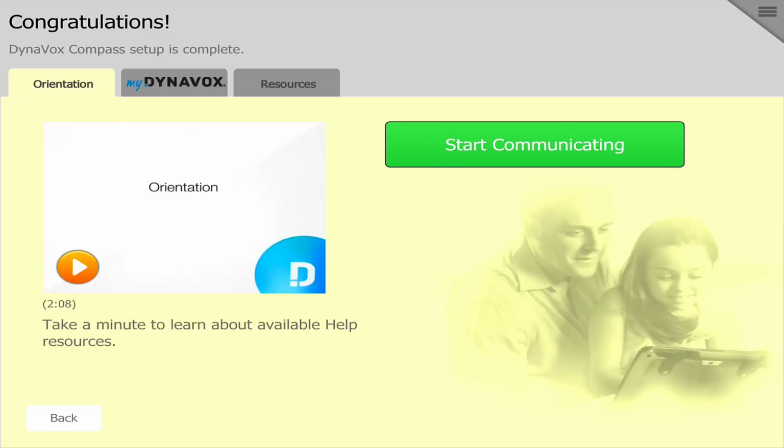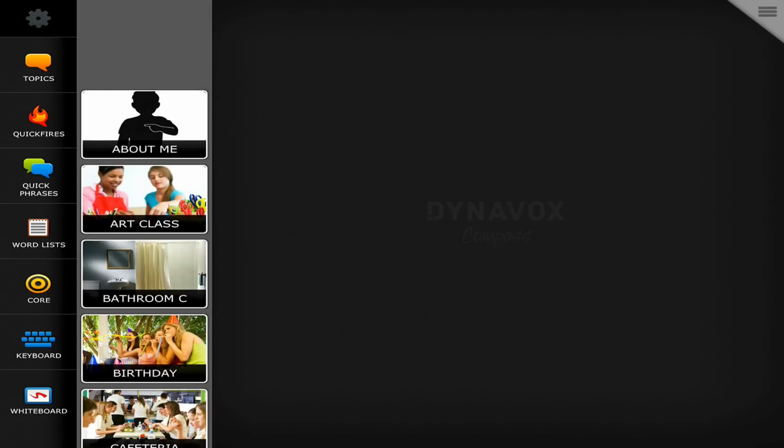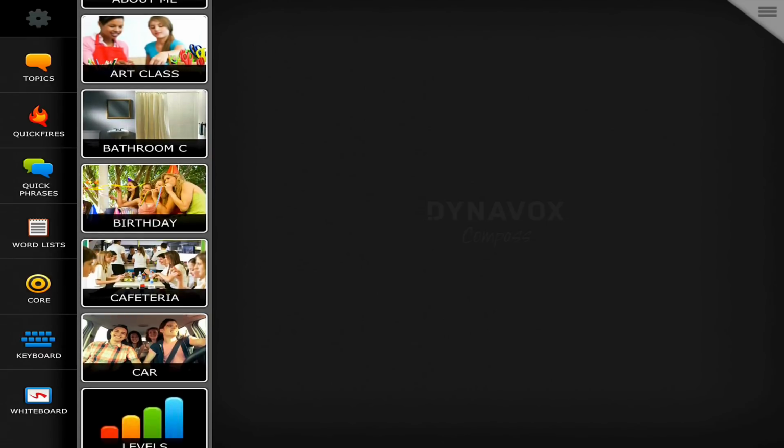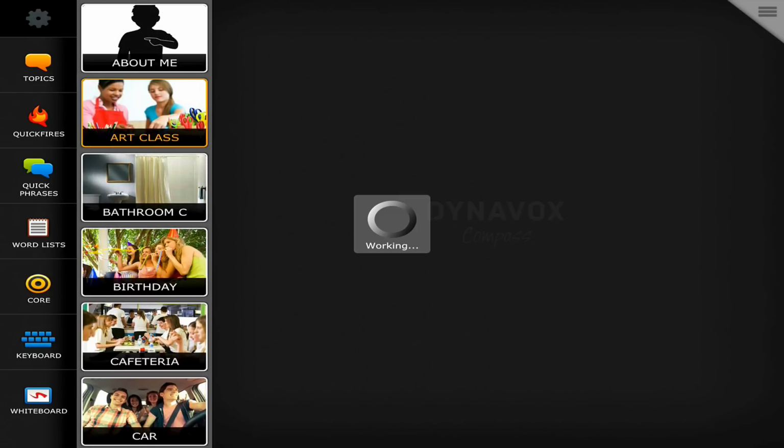So now we can choose to start communicating. And our page set comes up. This is the Navbar page set. So on the left-hand side, we have like a title or a topic bar on the far left. And then we have all of our topics, scrolling sort of a list there. So I can tap on one of those, which is art class.